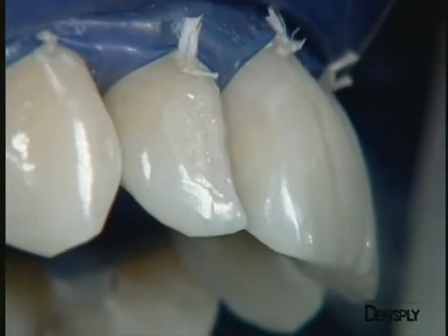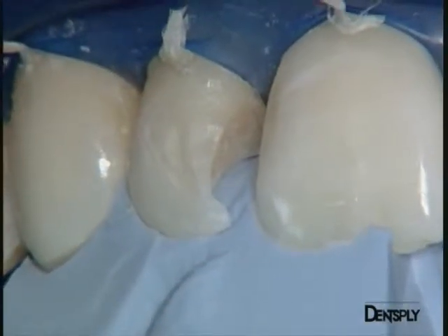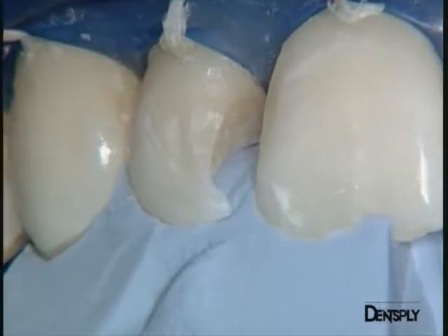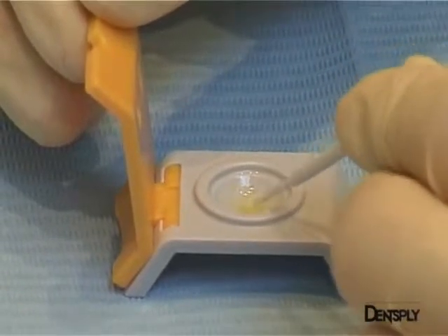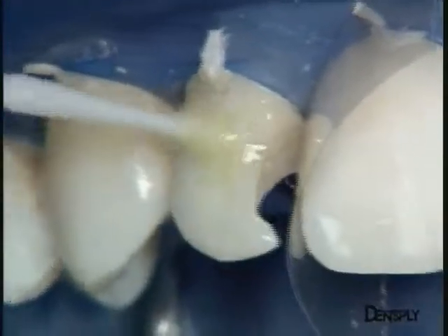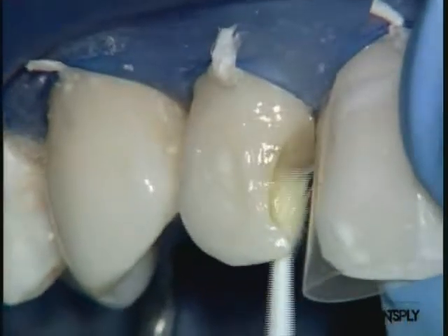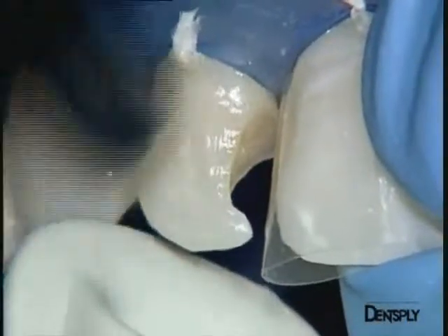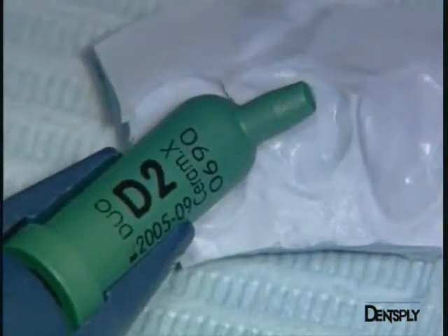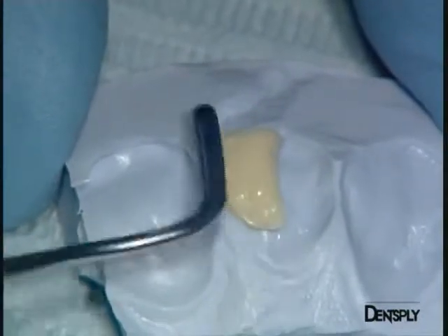We can now deal with the lateral incisor. In view of the amount of material required for this restoration, the silicone key will of course have to be used. The adhesive procedure must first be performed — the hybrid layer is once again prepared with Xen03. The material is applied generously and left to penetrate for 20 seconds. A brief blast of air removes any excess, especially solvent, and polymerises the adhesive. The dentine replacement, Ceramix Duo D2, is placed on the silicone key. The Ceramix Duo does not stick at all to the spatula and is very easily applied to the key.